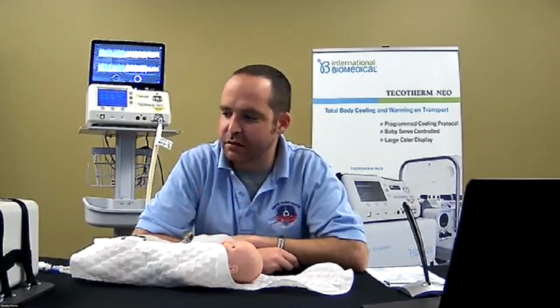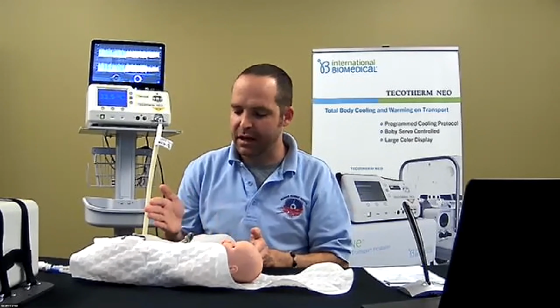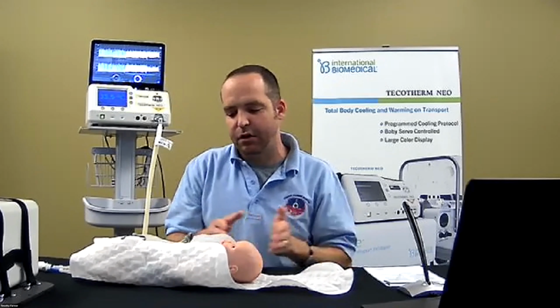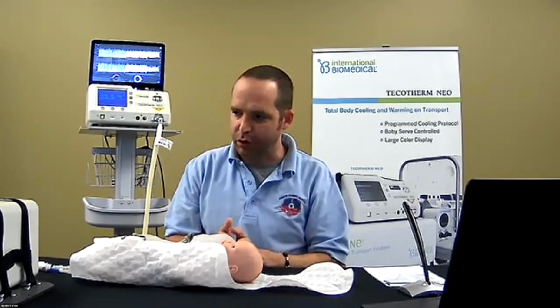Whether you're a standalone team or a unit-based team, the other piece that we looked into deeply when we incorporated the Tecotherm was bedside report. If you're transferring into a unit that is going to be using a different device, you need to make sure that the SBAR, that bedside report, makes a firm line of when therapy was actually started. We were a team so used to doing passive cooling for so long that when we arrived at the unit, that's when our therapy would start, and we'd go on from there.